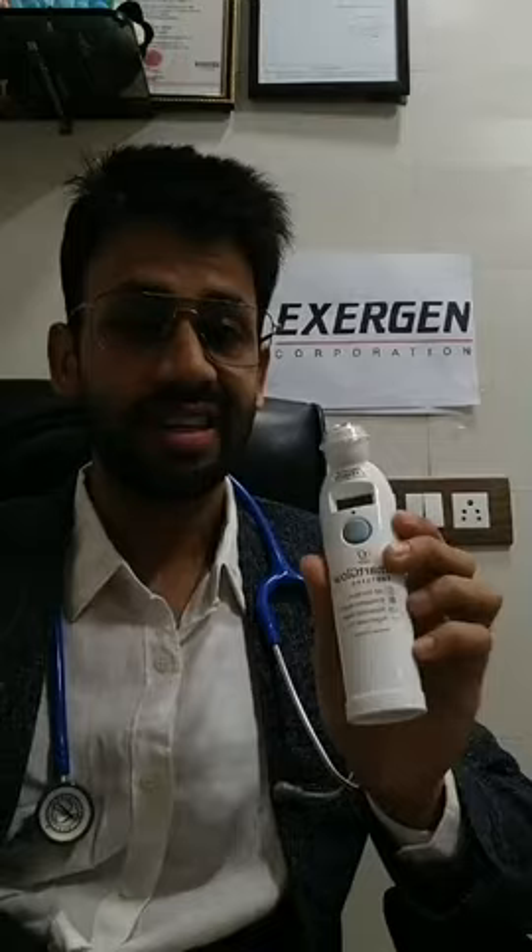It is very easy to use. Just press the button, keep the button pressed, remove the cap, keep the button pressed and scan it — and it's done. Like that. So yes, you can take this. It is a Temporal Artery Thermometer, very easy.